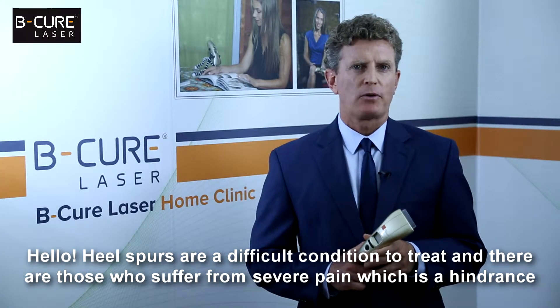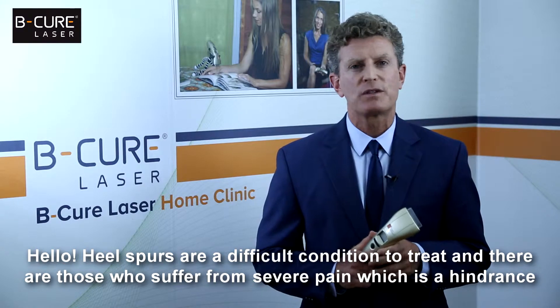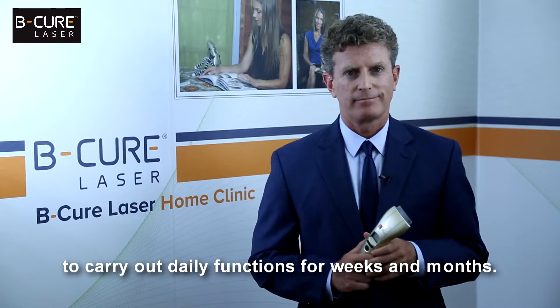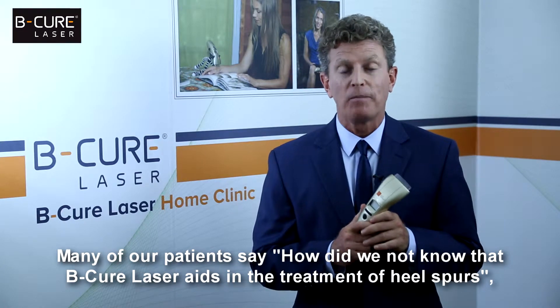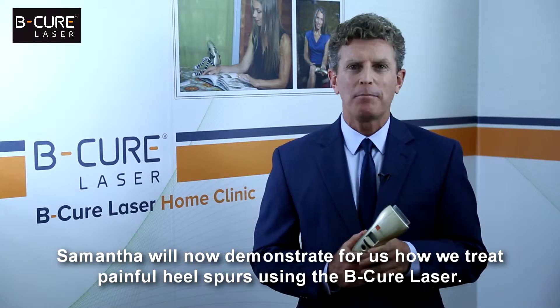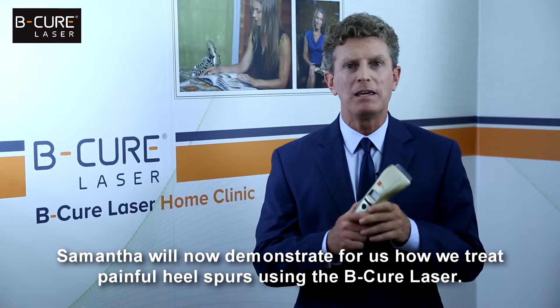Hello. Heel spurs are a difficult condition to treat and there are those who suffer from severe pain, which is a hindrance to carry out daily functions for weeks and months. Many of our patients say, how did we not know that BeCure laser aids in the treatment of heel spurs? So now you know. Samantha will now demonstrate for us how we treat painful heel spurs using the BeCure laser.